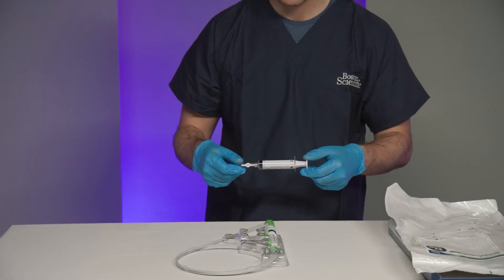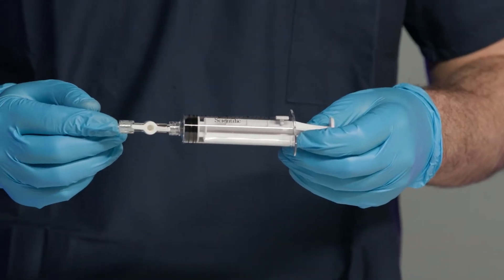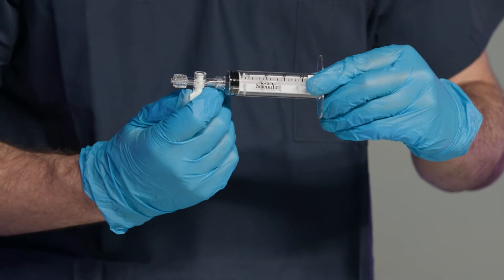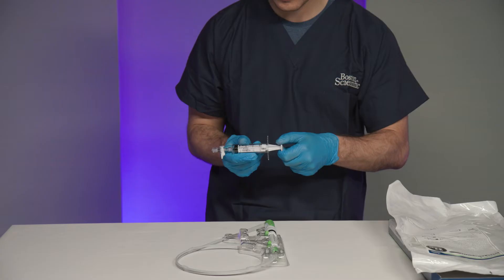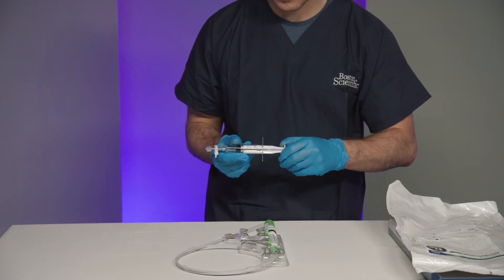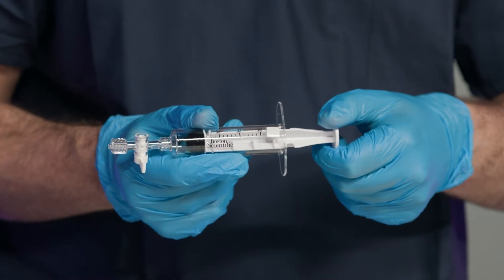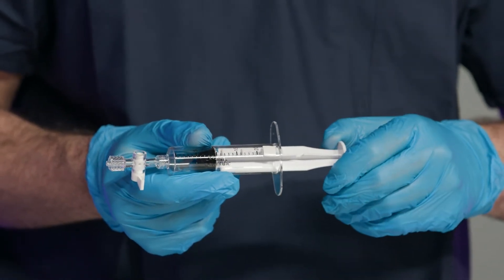Ensure you visually inspect the syringe stopcock to confirm it is in the open position; otherwise, do not use it. Prepare the syringe for use by turning the stopcock to the closed position. Set the syringe suction by pulling back on the syringe plunger until it aligns with the desired suction volume, then turn the plunger clockwise so that the locking pin engages with the locking fins of the plunger.